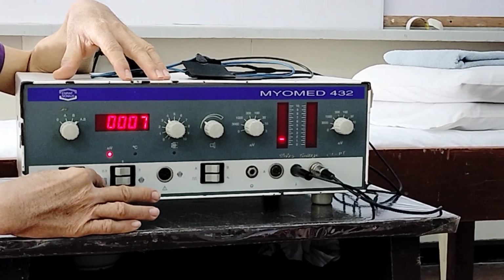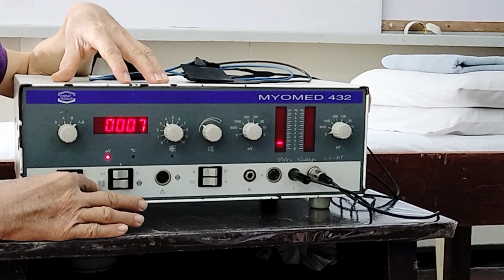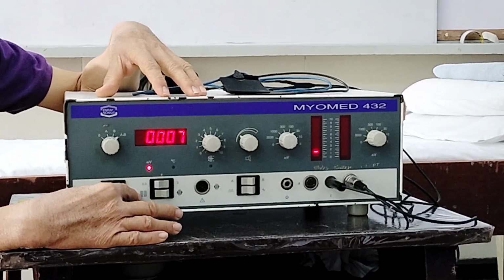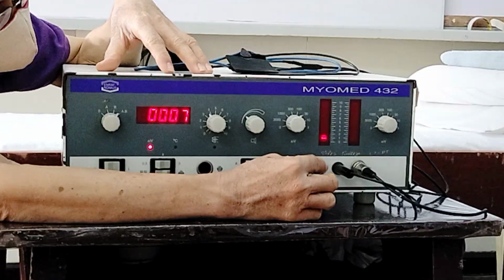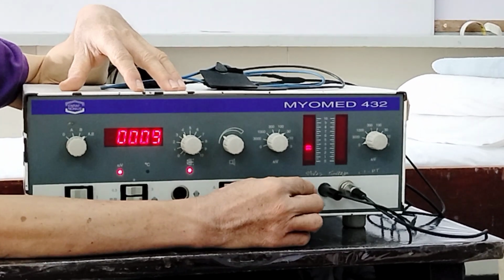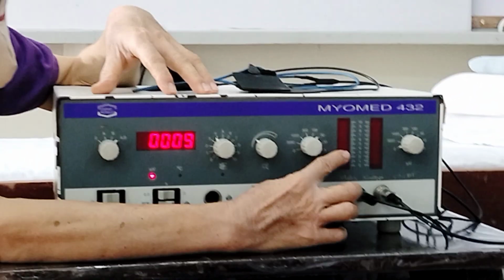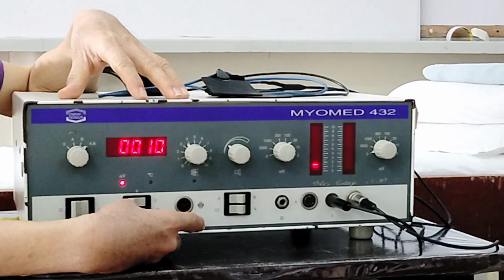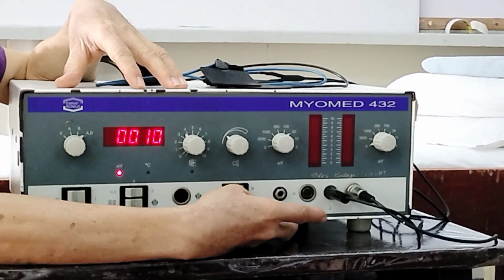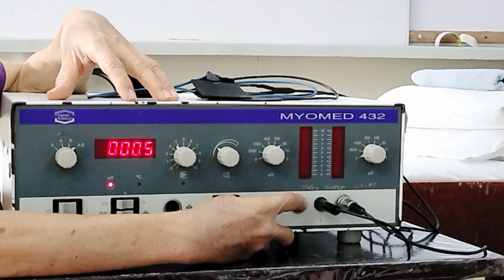Okay, next, further below, there is a selector switch for the visual display of the modality. On the left side, you have the symbol for bar display. With bar display, you can see the bar go up. If you place this on the right side, there is no bar display.